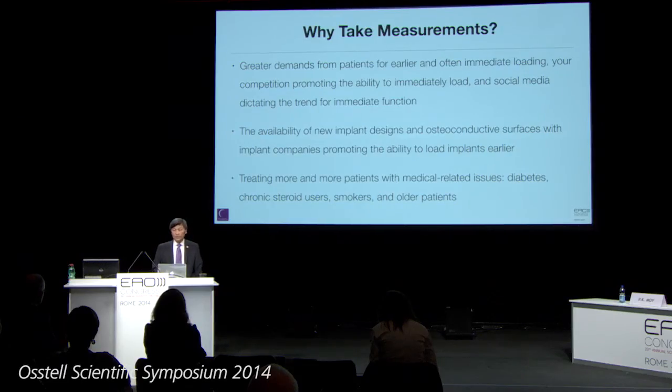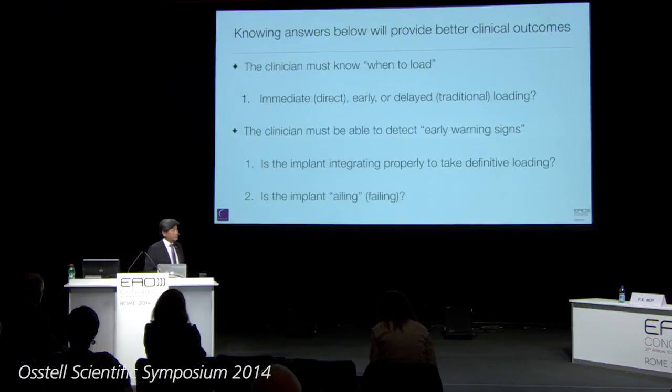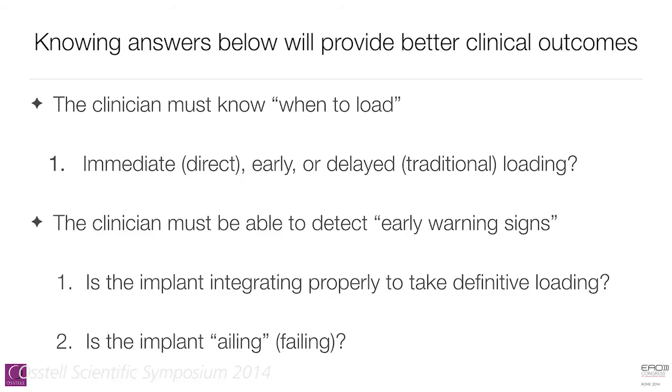And all of a sudden, we're sitting there going, okay, we want to treat you as our patient, and we need to deliver what that doctor promised down the street. And so this is the reason why we need to take measurements, because if we are going to provide answers for our patients, we have to know how stable that implant is.